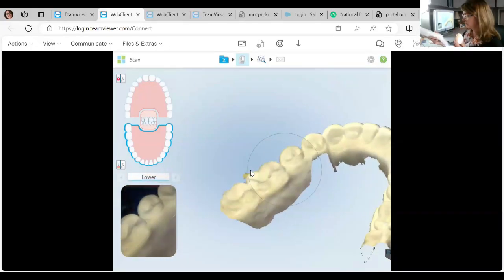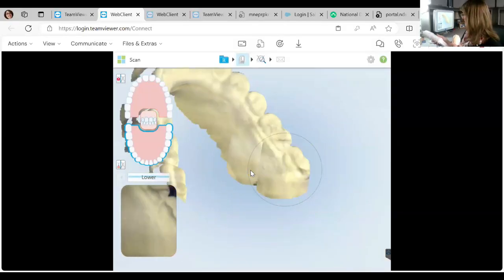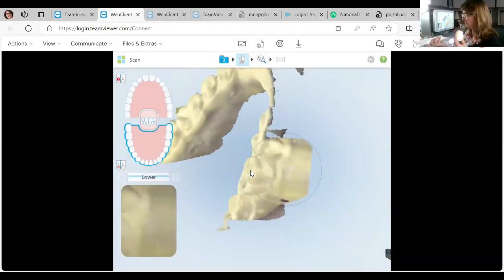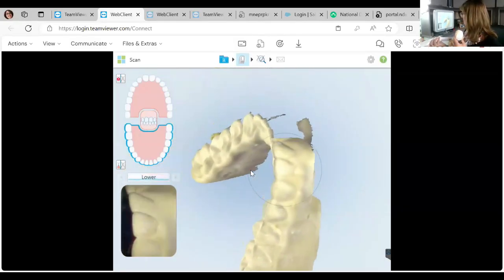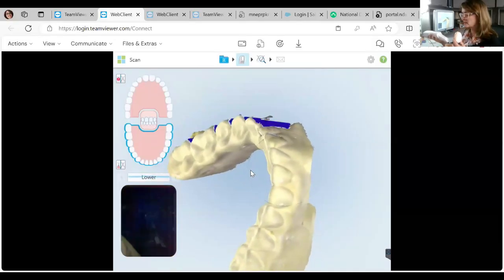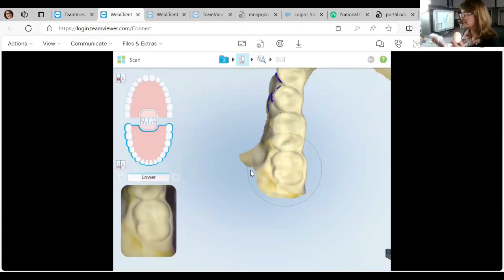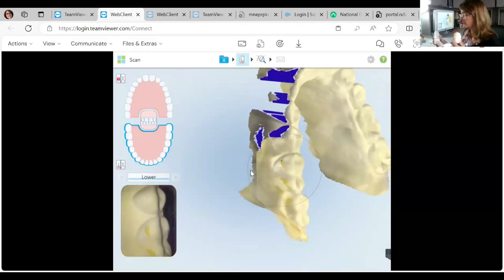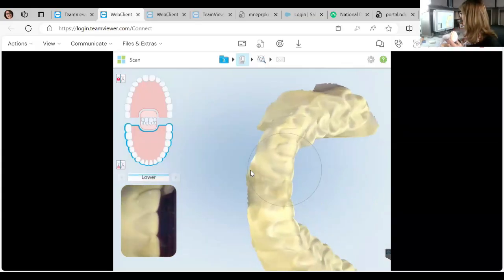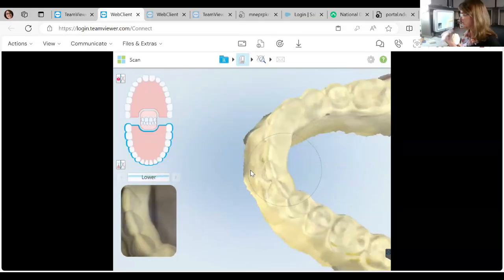And again, it's always occlusal, lingual, buccal. And this is an articulated model. When I get to the midline, just with any full arch, I'm taking the wand out of the patient's mouth, but I'm leaving it on. I'm coming back to the opposite side, rotating buccally, coming back across, crossing the midline, and tagging back up on those incisal edges.